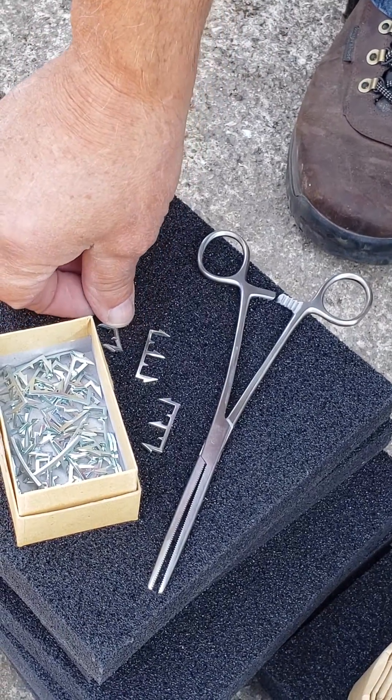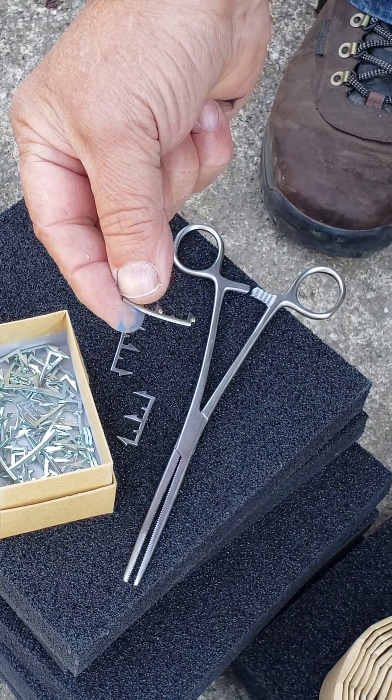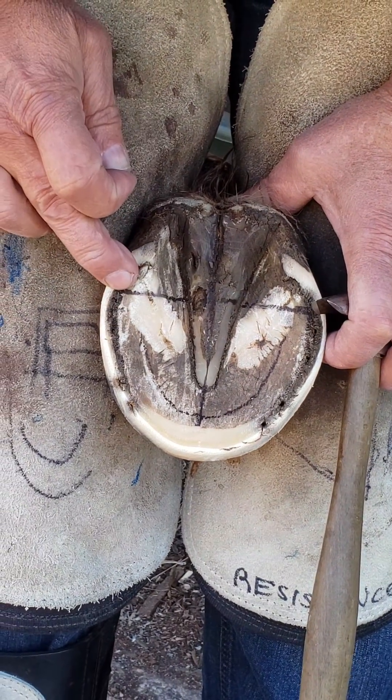I'm going to use a cadaver and show you how to put in the DE hoof taps, where we have some separation here in the quarter just forward of the heel.